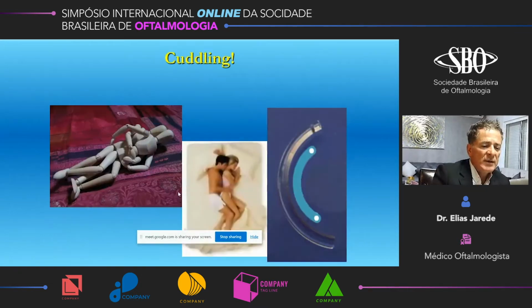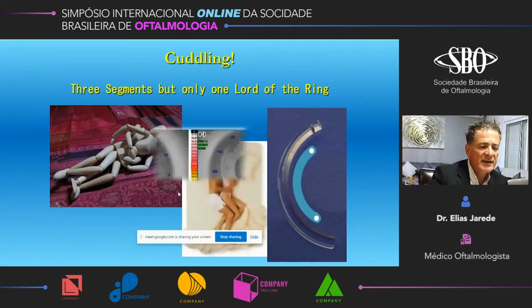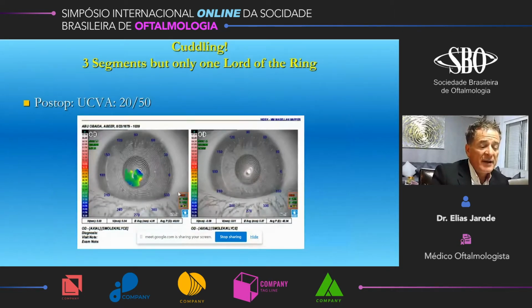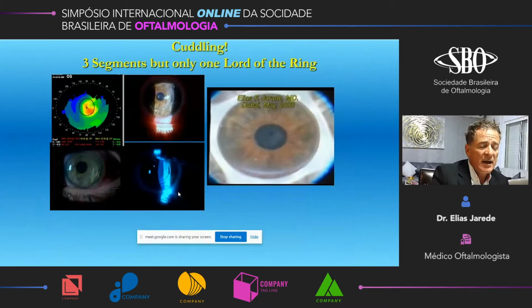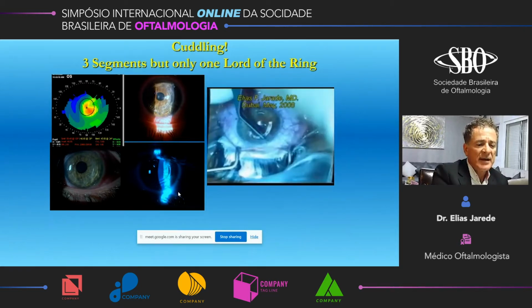With extreme remodeling, in some cases we cannot do more than surgery like a graft. In certain circumstances, the patient refuses the graft, or we have a high risk of graft rejection. We have nothing else to do, so we go with extreme remodeling. In such cases, we implant two adjacent rings under the steep zone of the cornea. Using the Intralase, we do two concentric cuts at two different levels. We make two different levels with some spare tissue between the two tunnels to prevent migration.